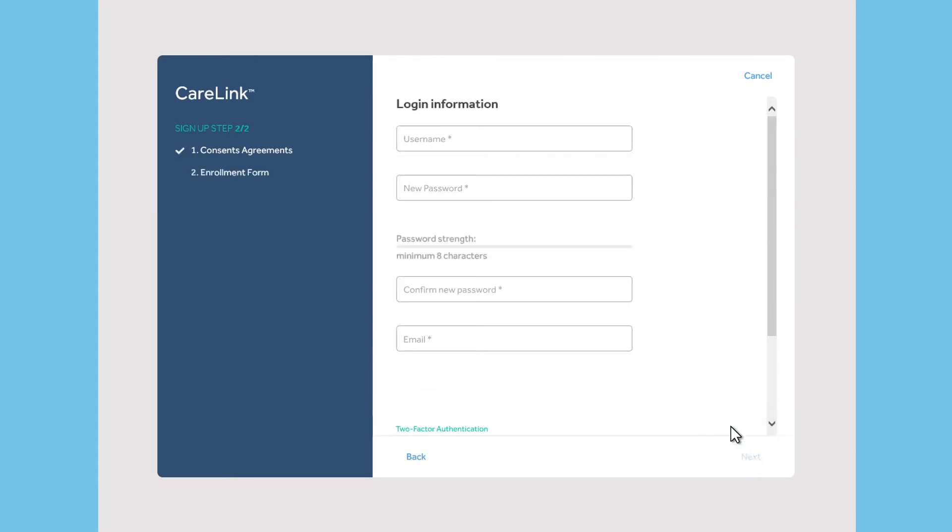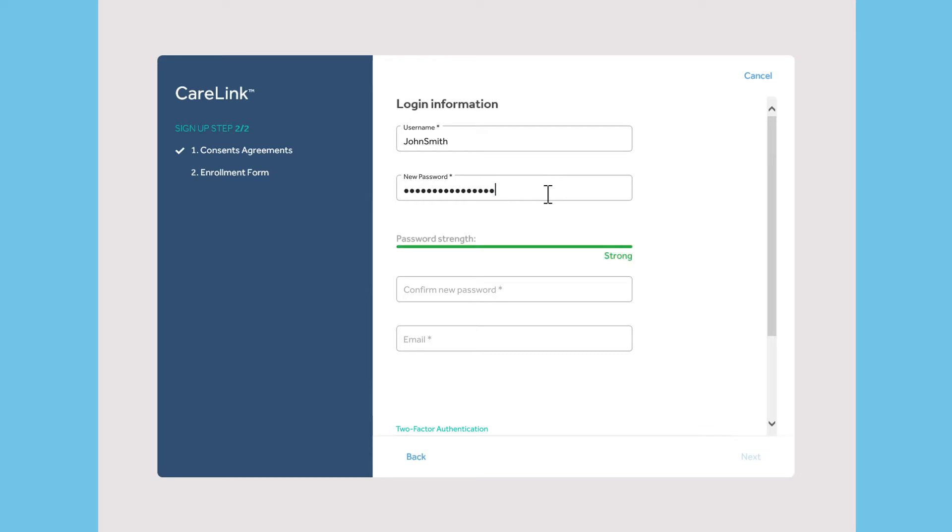Now, fill out the enrollment form and create your personal profile, which includes a username and a password. Please save this information in a secure place for future reference.